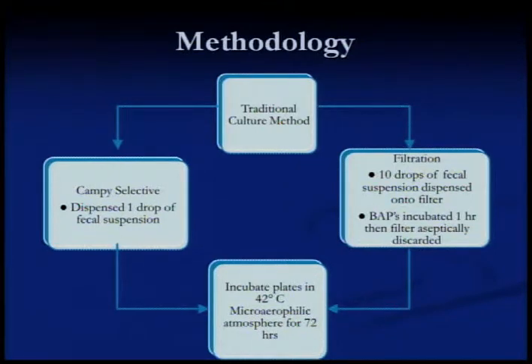Both the Campylobacter selective medium and the BAPs were incubated in a microaerophilic atmosphere at 42 degrees Celsius. They were incubated with a Campylobacter gas generating system for 72 hours in an enclosed jar. The plates were then examined for the presence of small, gray, watery, non-hemolytic colonies.